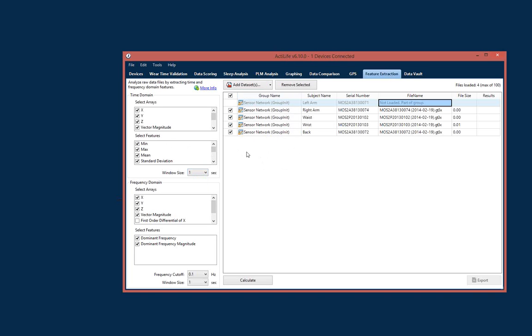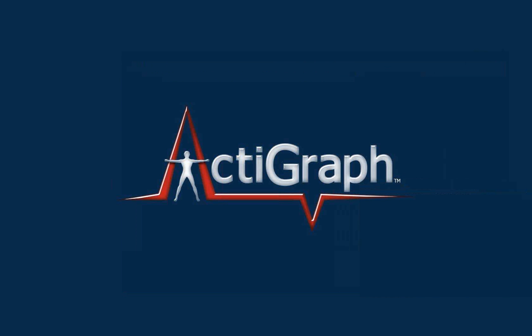So I'm really interested in hearing your applications for this, if you have some ideas or use cases that you think would be helped by this group initialization feature. The entire point of this tool is to make your lives easier, and so we'd love to hear from you and understand how you might use this feature, or if you can think of an adaptation of this that may be a little different than what we've done that might be helpful. We would love to hear your opinion on that.